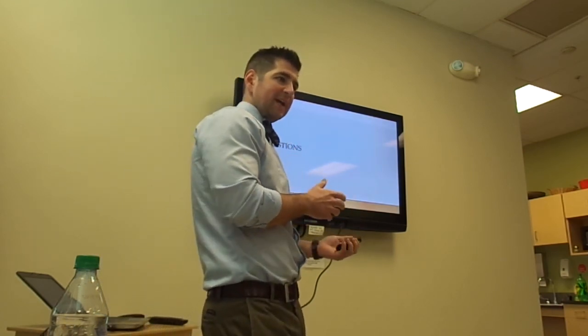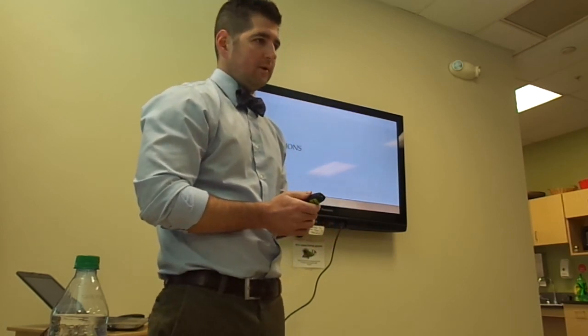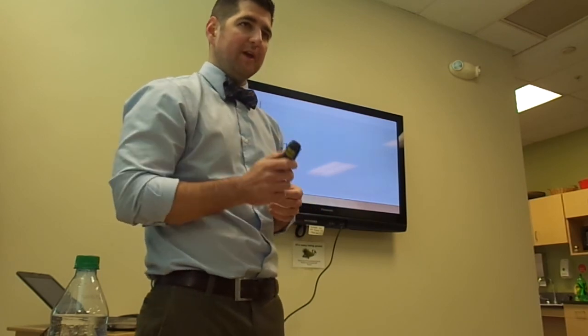So usually by the time I get done with my debridement, they'll have one or two of the samples back, and if we're headed in the right direction, we'll start the reconstruction, or we'll start opening up the antibiotics or something like that.